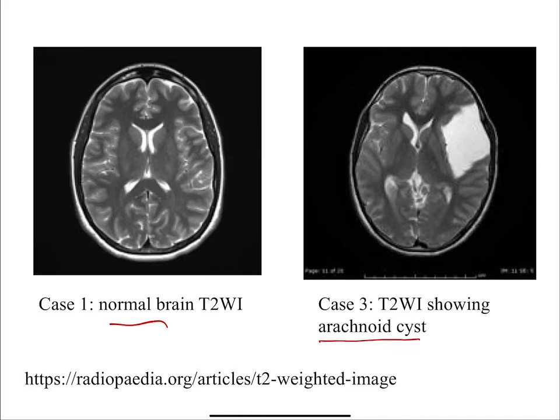Right? So if I have a T2 weighted scan, those fluids will be very, very bright because they have not decayed very much. Okay? So therefore, the brightest things on this image are these parts here. These are your ventricles, which are filled with cerebral spinal fluid, which is very much like water with stuff in it, okay? And then this is also fluid filled. All right.